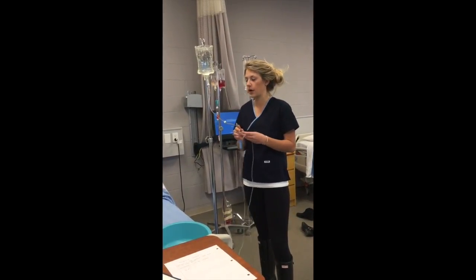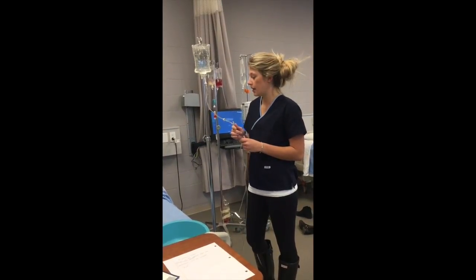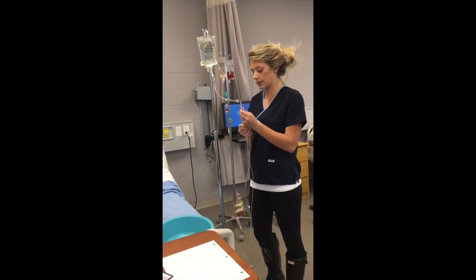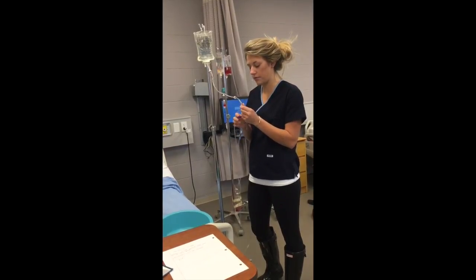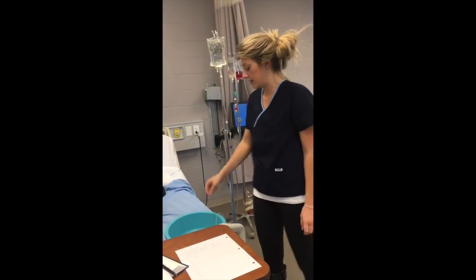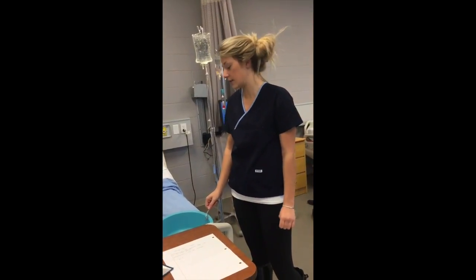From there, we want to ensure that our line is patent, so we want to make sure there's no bubbles or air stuck in the IV line. So you're going to hold your ports up, and I would release the fluid. And slowly my ports would fill up. That port's full, and I would let it drain. And the tip of the IV line where you'd be inserting it into the IV catheter is always sterile.